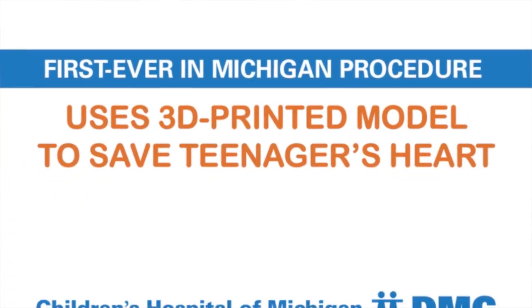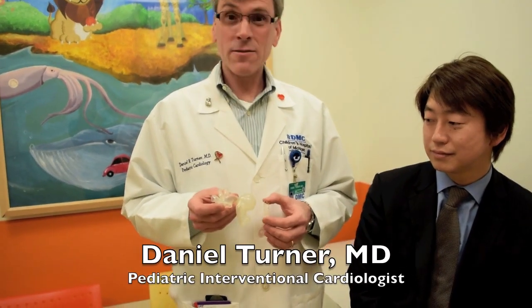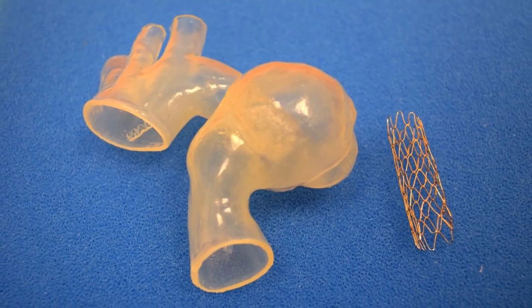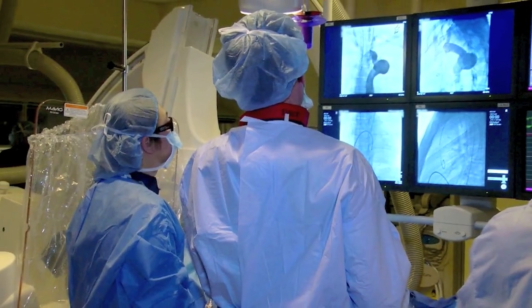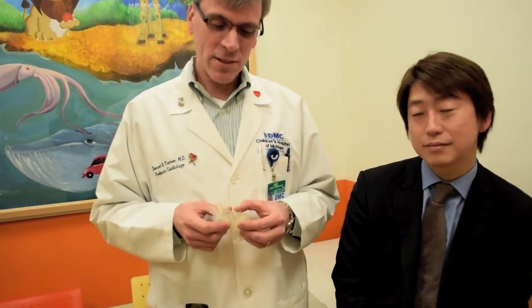The exciting thing about this in my mind was the fact that we had a model of the patient's heart to then plan the procedure in detail and to actually practice putting a stent in here to see how it would behave, and then to use that information to go and treat the patient in the cath lab.